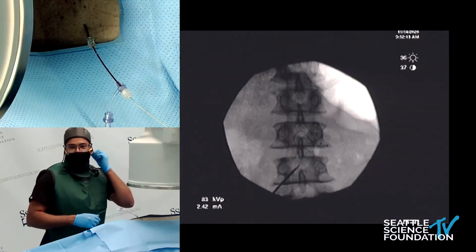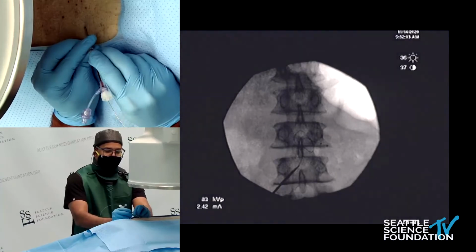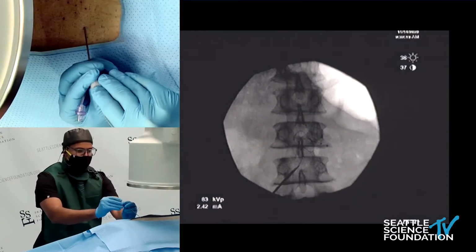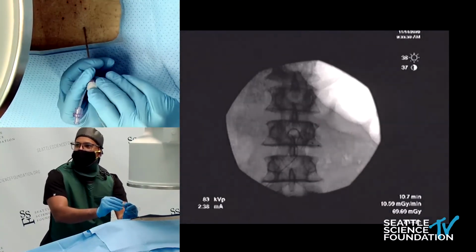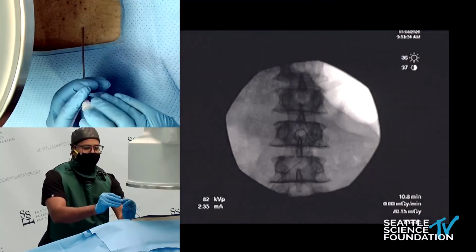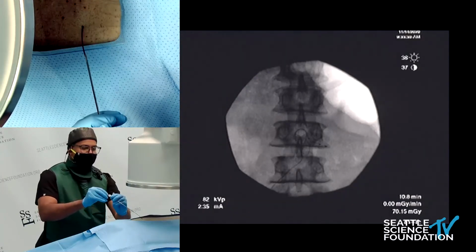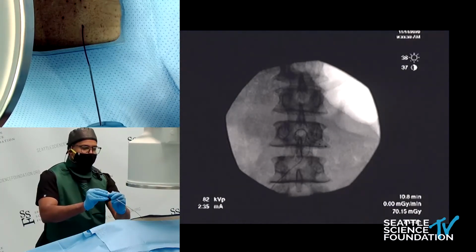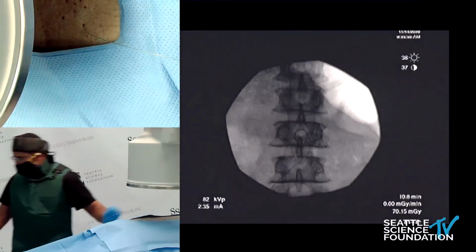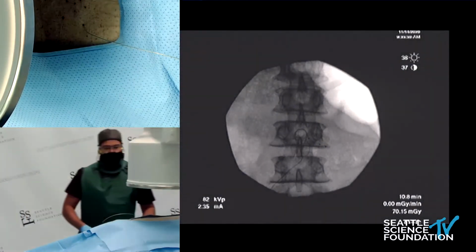Sure. So I'm going to demonstrate, we can do it with this DRG lead here itself, how it goes to place an IPG. So I'm just going to feed the lead and ensure that that remains in place. So we'll talk about the IPG implantation with the DRG, but really the same principles can apply to spinal cord stim here. Tyler, is it possible to bring over a scalpel and... Perfect.